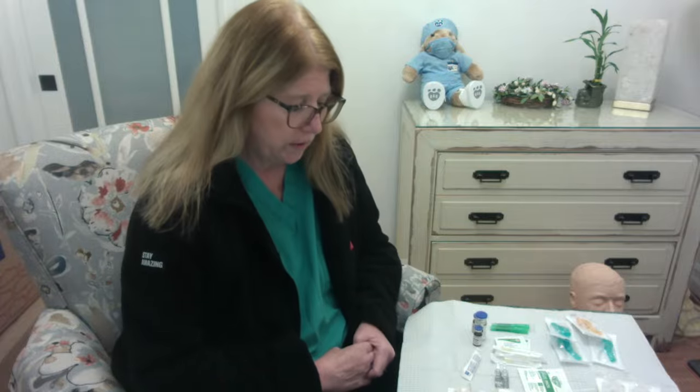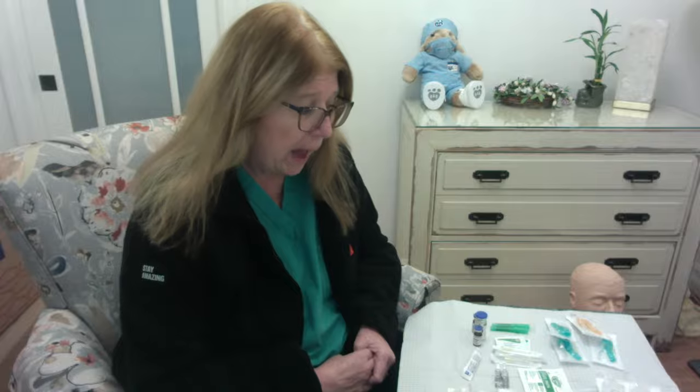Hi everybody, and welcome to a video that is the start of parenteral medications. So in this video I'm going to go over the use of ampules, the use of vials, some reconstitution of a powder into a liquid, and then finally some injections. So let's get started, first becoming a little bit familiar with some of the equipment that we have.